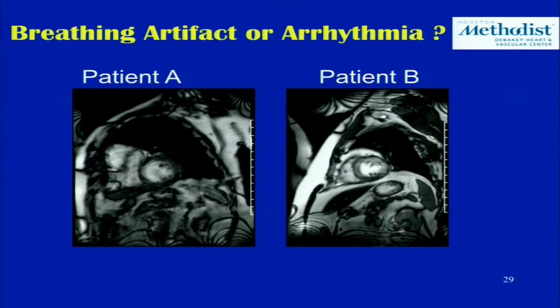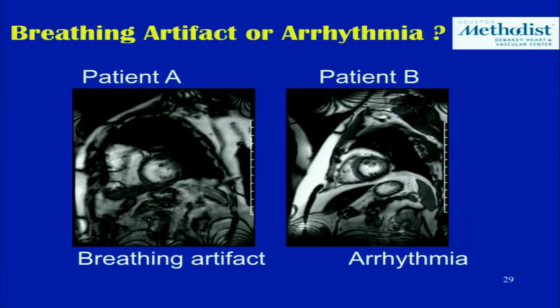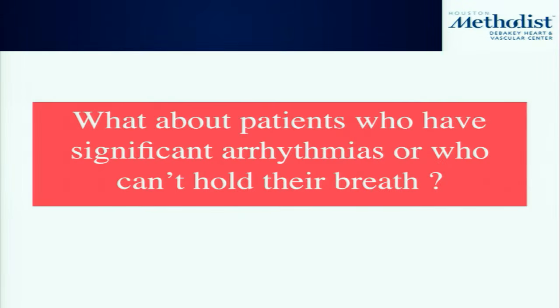Here are two cases. Again, can you tell which is the breathing problem and which is the arrhythmia problem? Raise your hand if you think left is arrhythmia. Raise your hand if you think the left is a breathing problem. Yeah, that's pretty good. So you guys are all ready to come rotate in the MRI lab now. But the key is you have to be able to recognize this to then troubleshoot and figure out the problem.